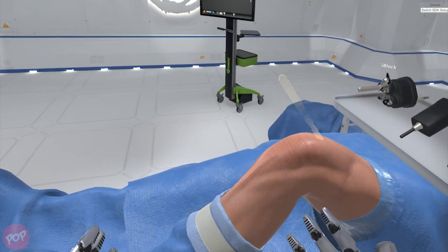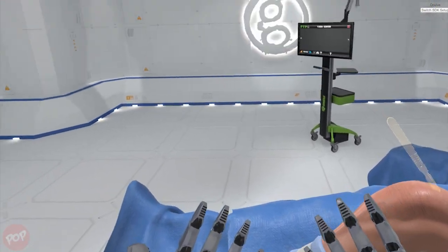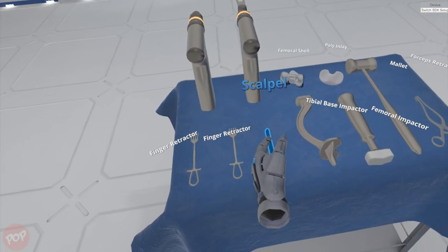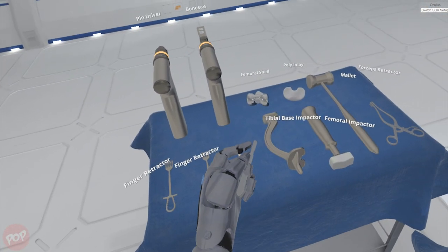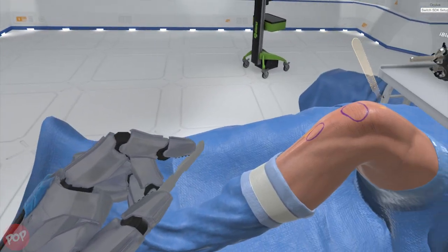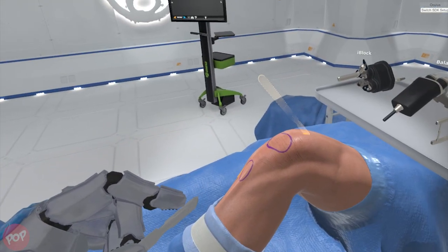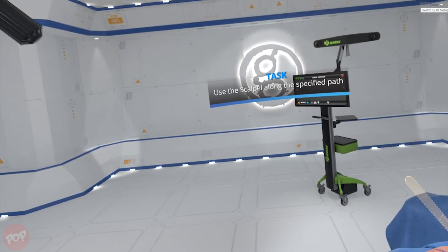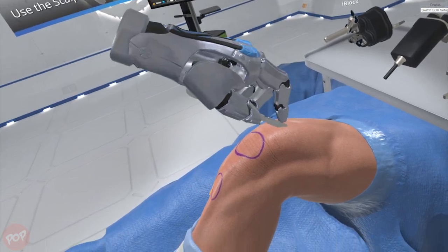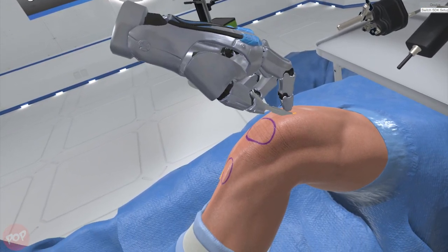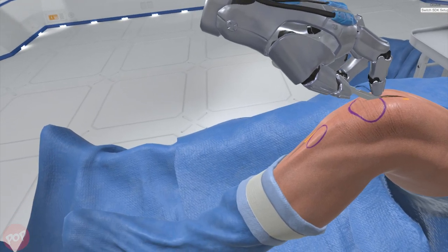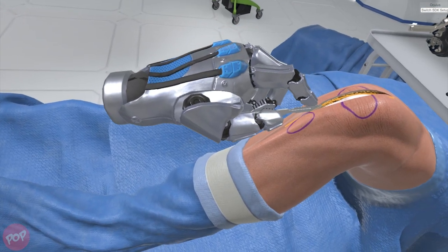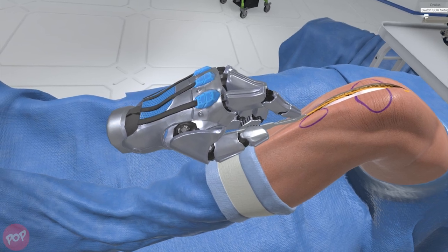Select the scalpel from the Mayo stand to your left. You will see a linear highlight on the knee showing the optimal path for the skin incision. Use the scalpel to make the incision starting just above the patella, extending over the patella, continuing down to the tibial tuberosity.